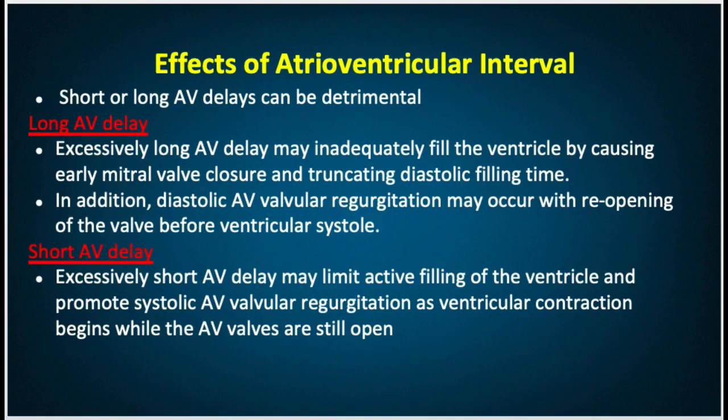In addition, with conventional right heart pacing, the activation sequence of left side chambers may be quite different from the programmed value due to marked interatrial and interventricular conduction delay.